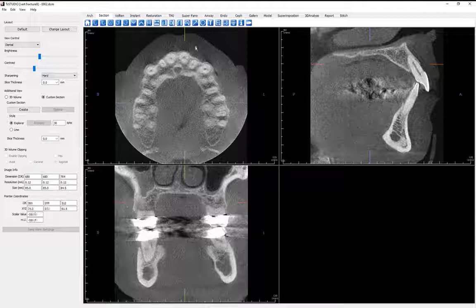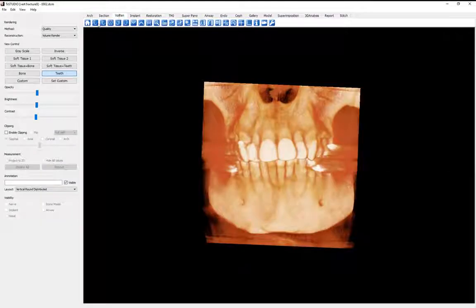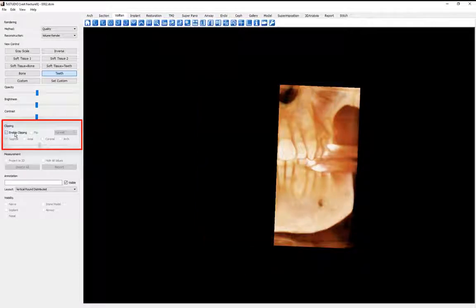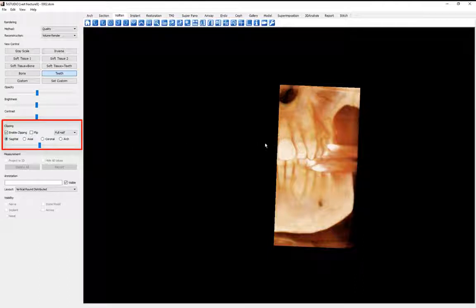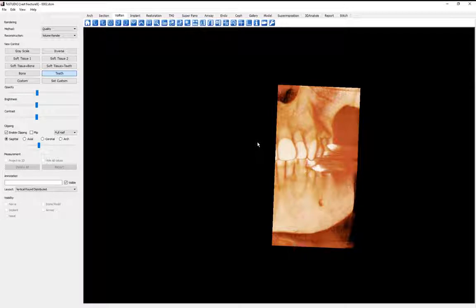You may want to view the fracture in the Volume Render View tab. I find it useful to enable clipping, then selecting an orientation and using either the slider or mouse wheel to scroll to the area of interest. Use the toolbar positional icons and/or left mouse clicking and mouse drag to arrive at a desired view.